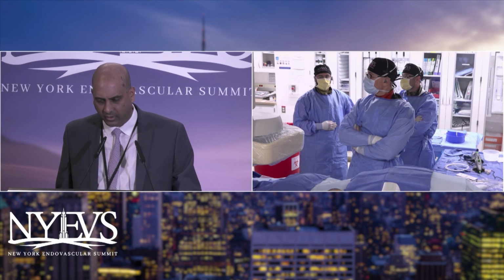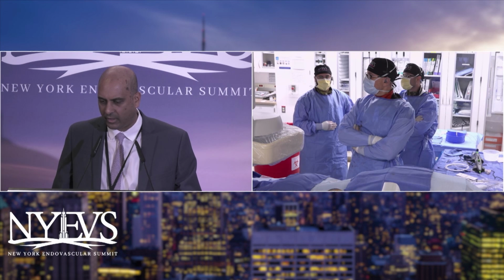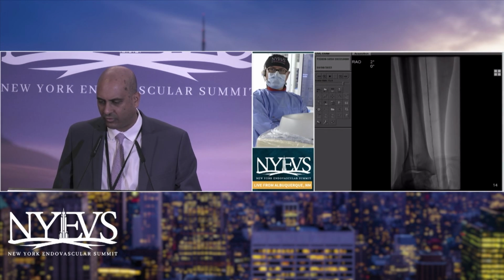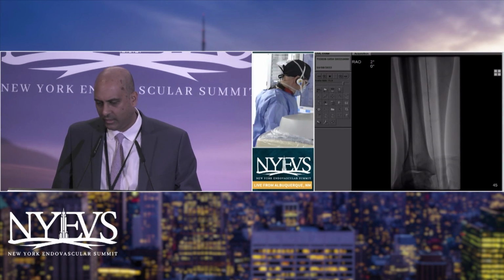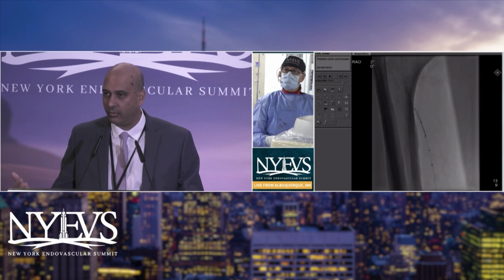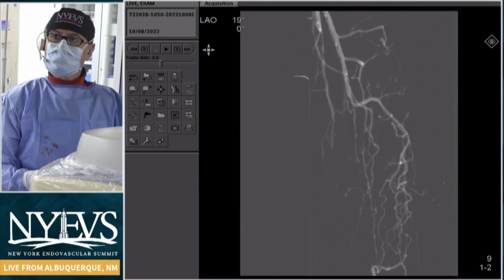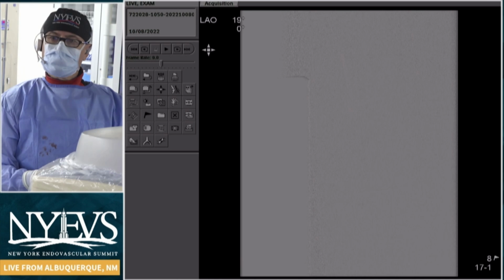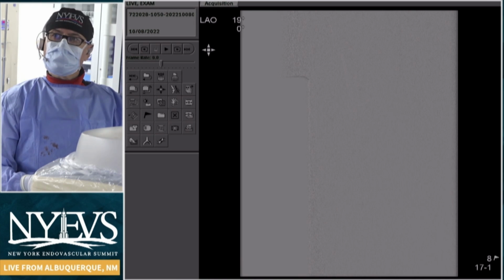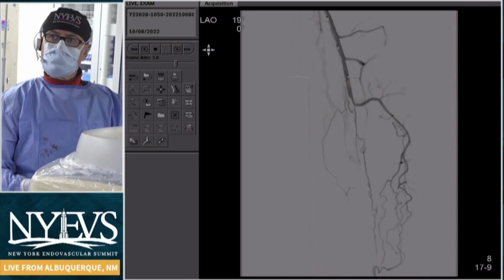I think the other thing to notice is that looking at the cap morphology is very important. And I think you showed a great demonstration of trying from above, using various guide wires, and then basically getting retrograde or pedal access right away. We talked about, do you put in a sheath, don't you? Many operators put in small sheaths, either a Cook or Merit sheath. I think the Cook sheath is like 2.9 French. Other people don't put in a sheath. If they're using it just for crossing, then they cross and then they fix from above.